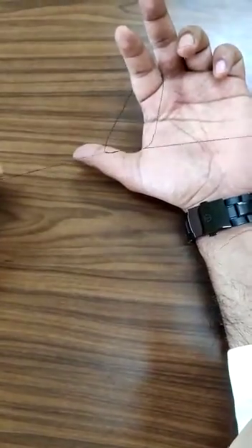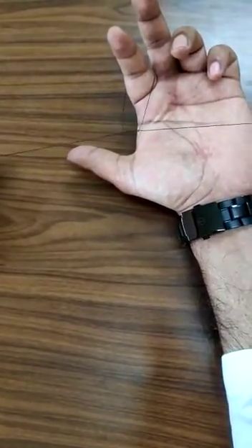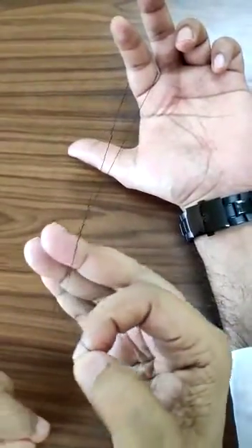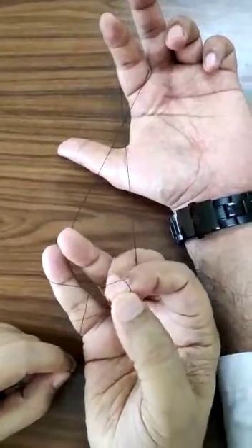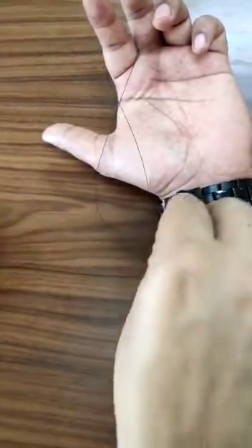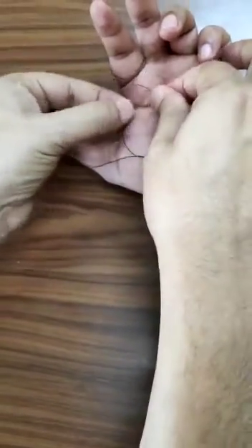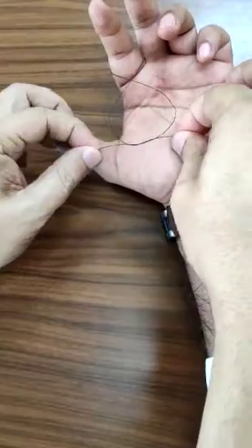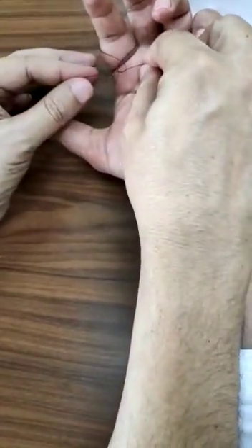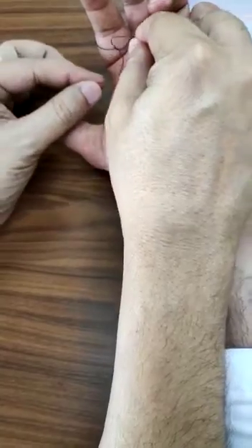This is square. Now I'll show you an unsquared knot. If I tie it like this, this is unsquared. Notice the meaning of unsquared — see how this knot is going to go down. These two threads are going this way and this is going like this. If it is allowed to sit there, you see it has already become loose.